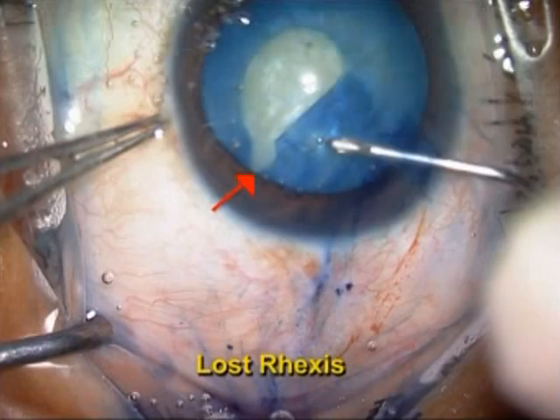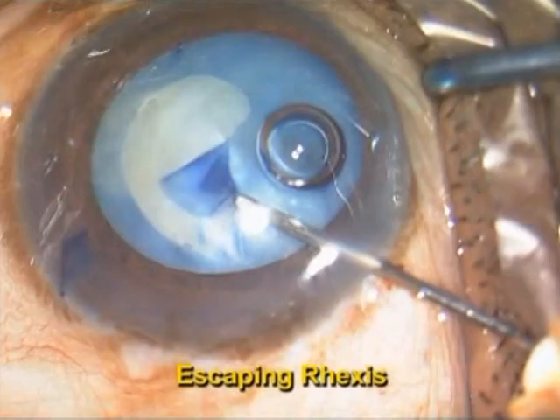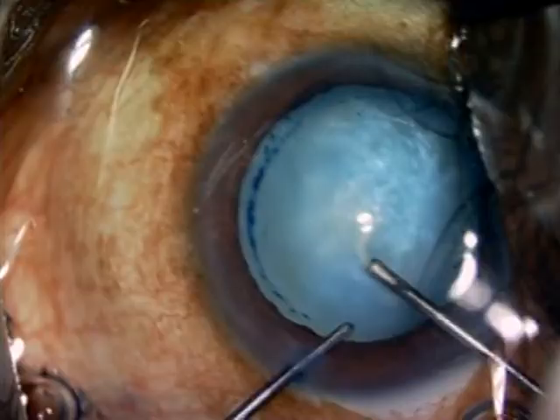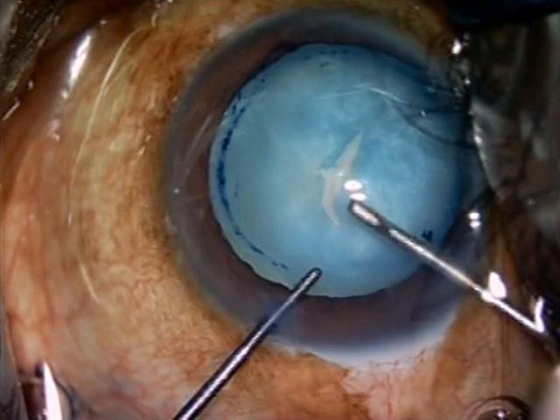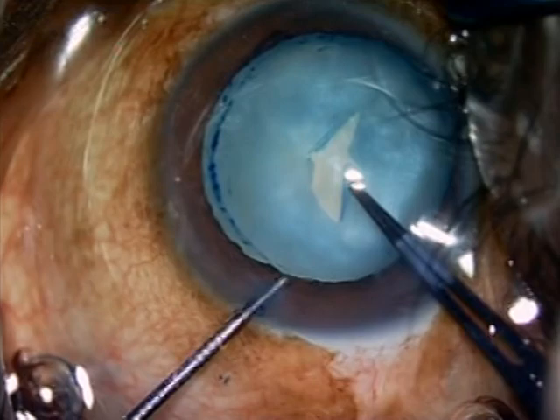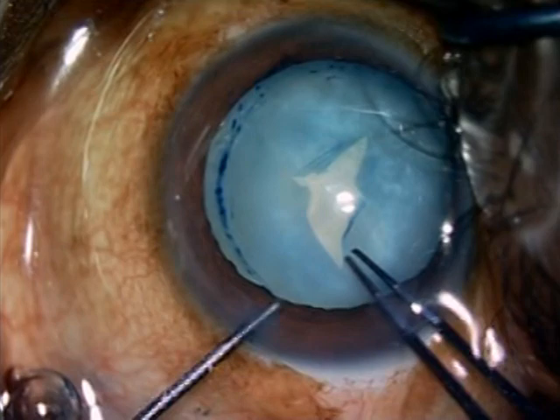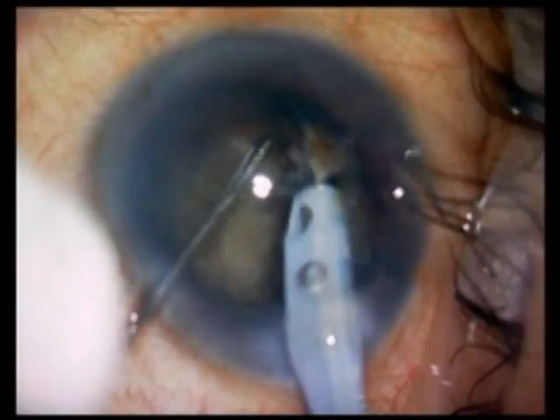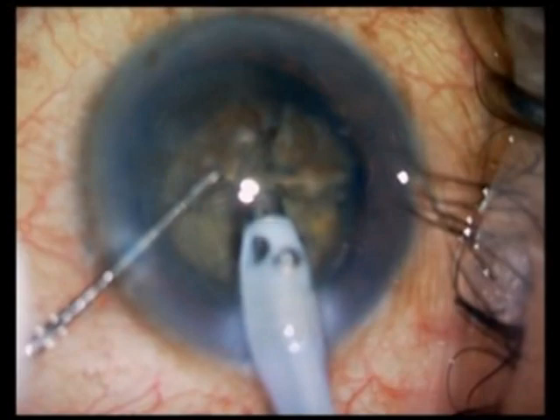This Argentina flag sign can be prevented to a large extent by certain maneuvers, which I am going to show you in this video. The problem with this Argentina flag sign is that the rhexis, because of the extension, can extend across the equator and go to the posterior capsule, thereby producing a posterior capsule rupture, or even a nucleus drop, as you can see in this particular video.